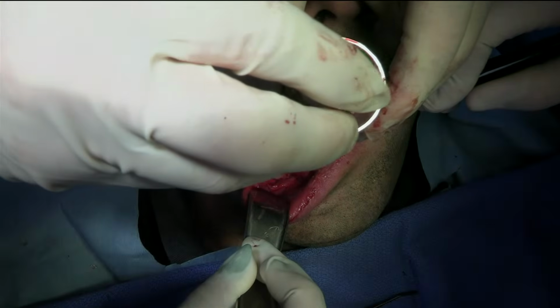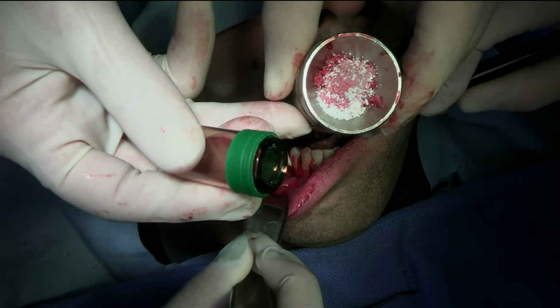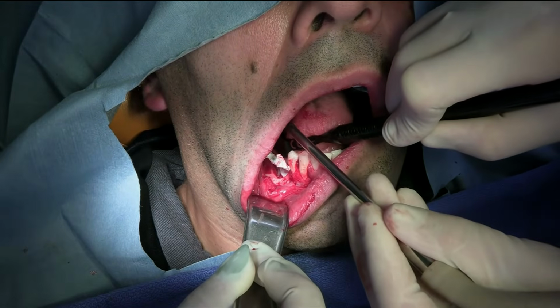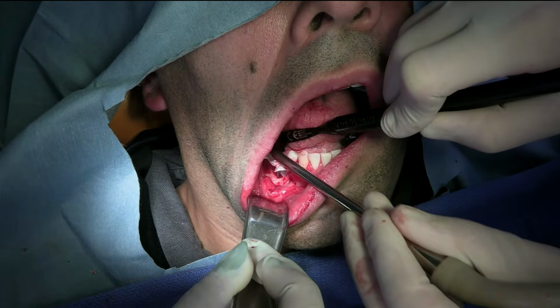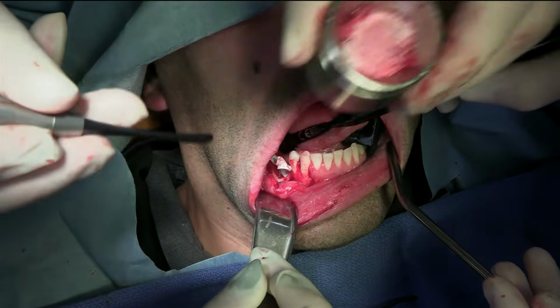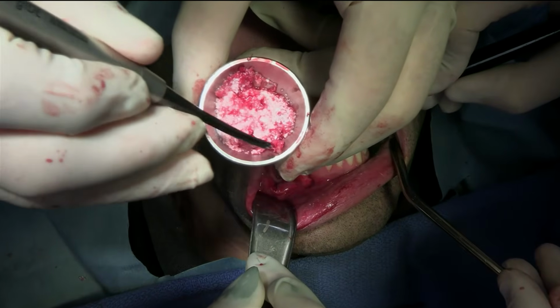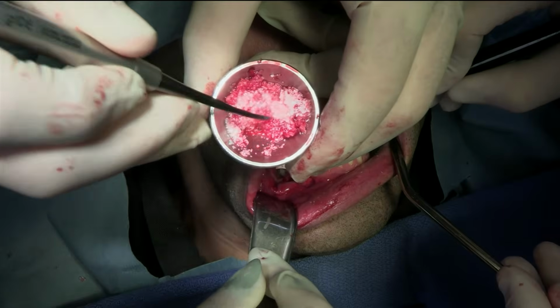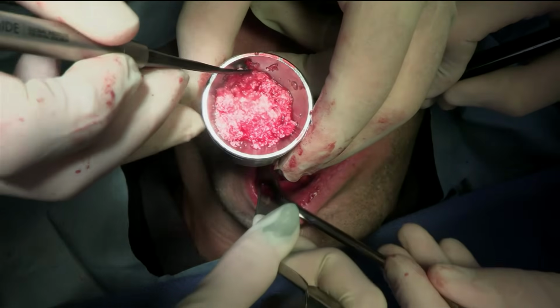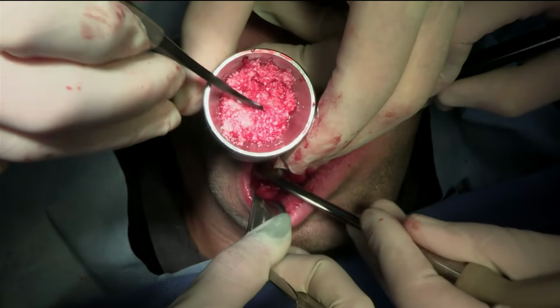So right now I'm easily 70% autogenous and 30% scaffold. And now we're just mixing this one. I don't know how big this vial is, how much volume there is, but I'm coming to at least half of it.